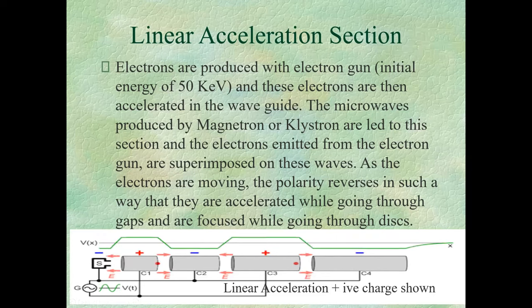The scattering foils are lead-based, and the thickness is such that electrons are scattered and do not produce Bremsstrahlung. There are still some electrons which are converted to X-rays and they come through. They are the X-ray contamination of our electron beam.